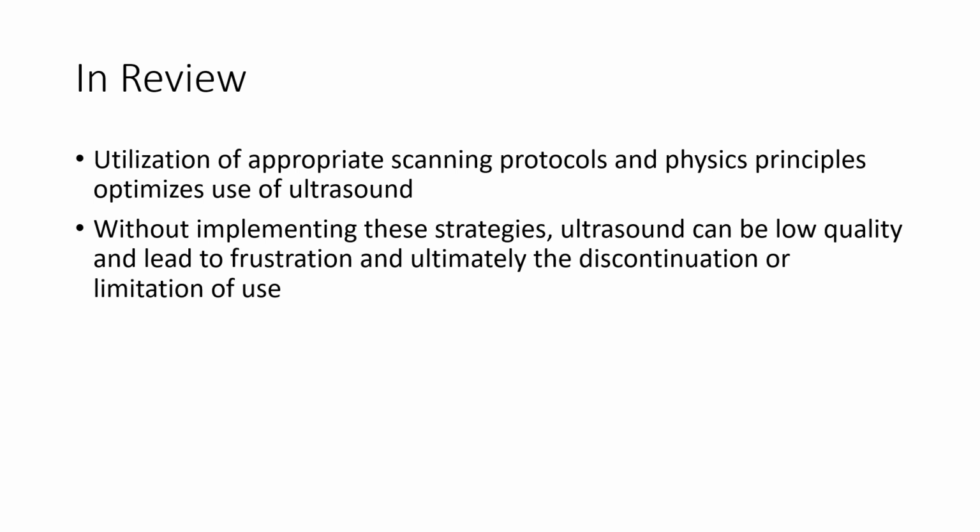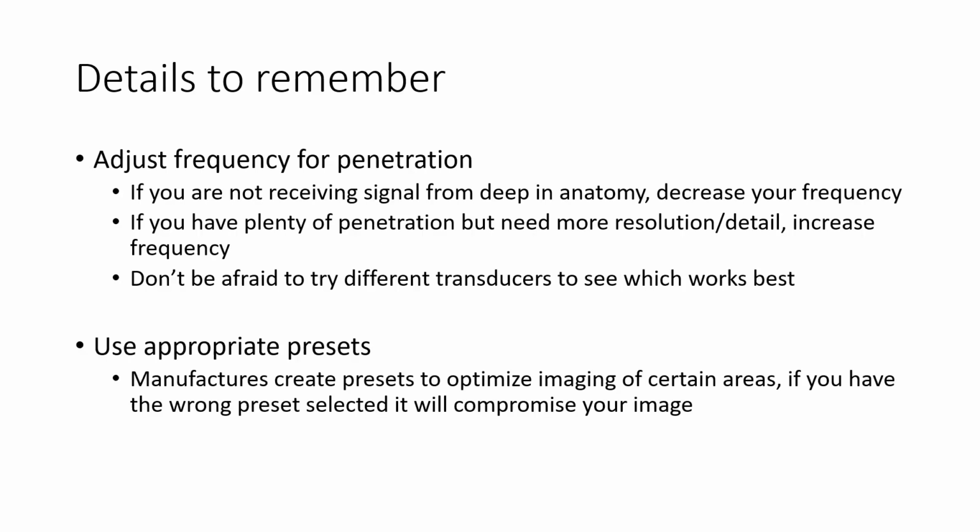When we don't have the skills to optimize our ultrasounds, lots of times we can produce low quality ultrasounds, which can result in a lot of false positives or false negatives, which can affect patient care, or just simply make it so that as a practitioner, you won't find it useful, or you'll feel that it's frustrating and give up on its use altogether.